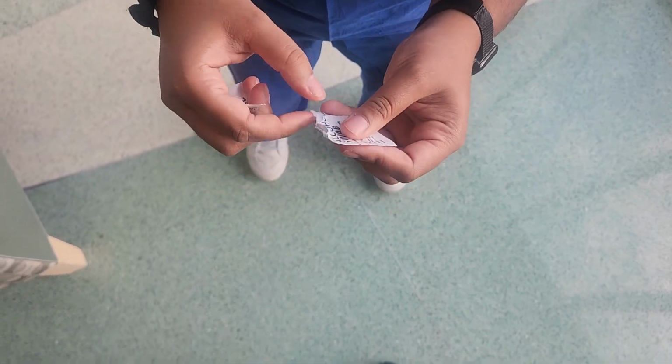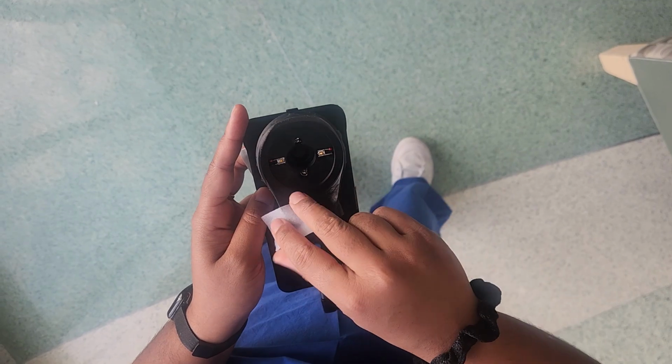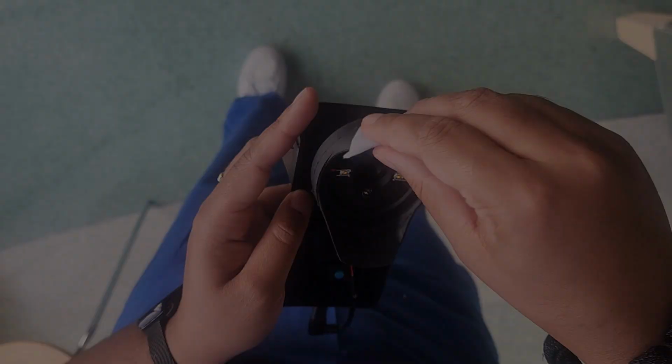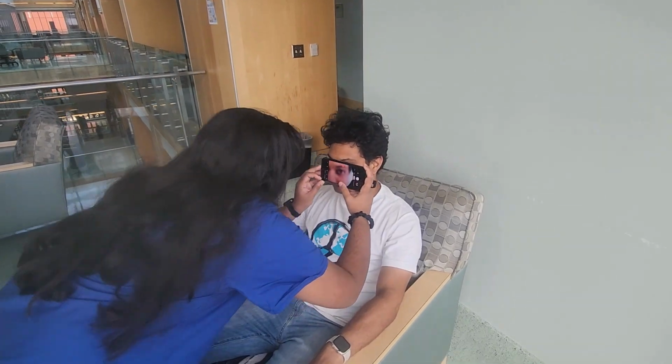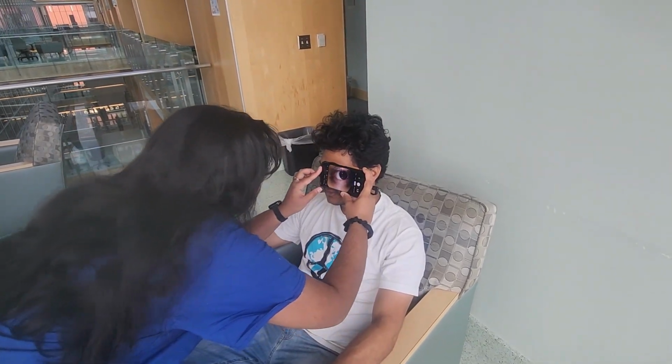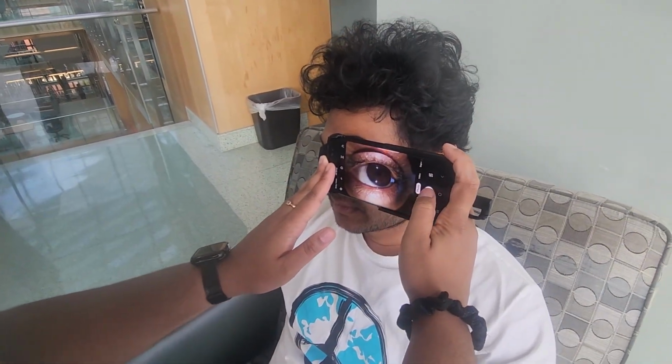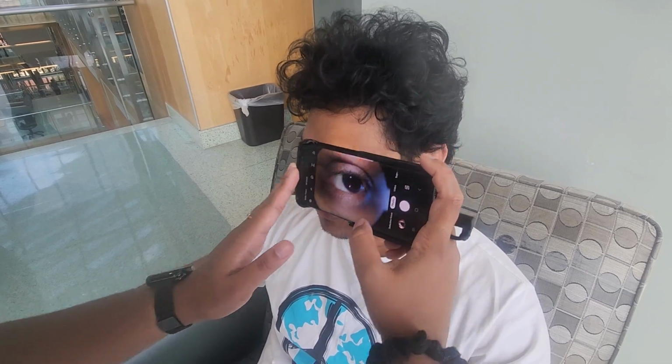Before moving on to the next patient, sanitize the scope with a wipe. This is critical to make sure you do not spread eye infection between patients. With practice, you can learn to take images quickly. Here you can see the technician pushes the camera all the way against the eye, directs the patient where to look, has them blink once, and then captures the image.